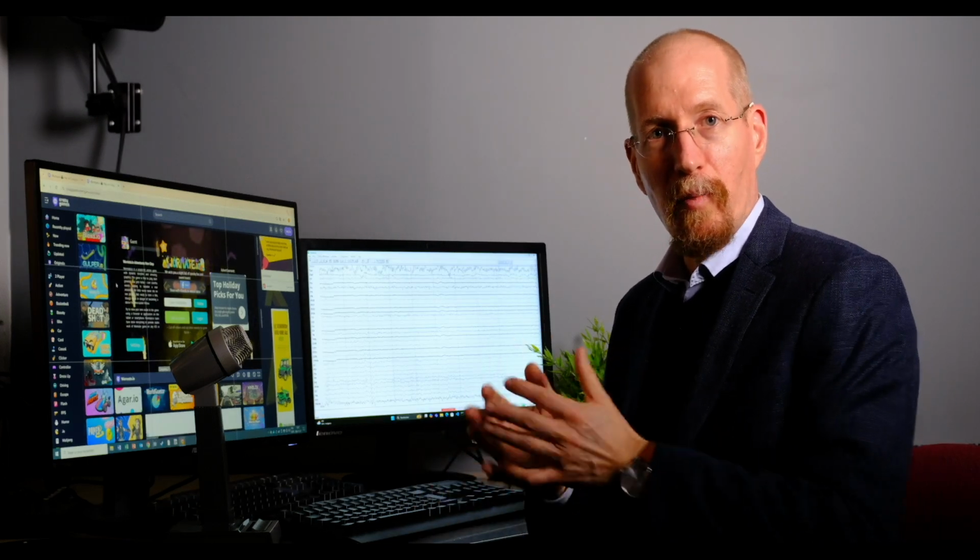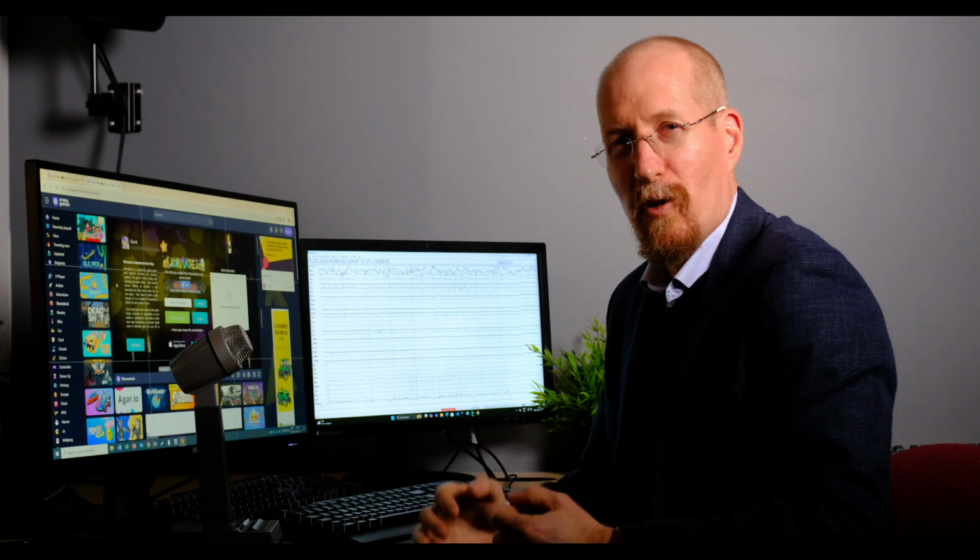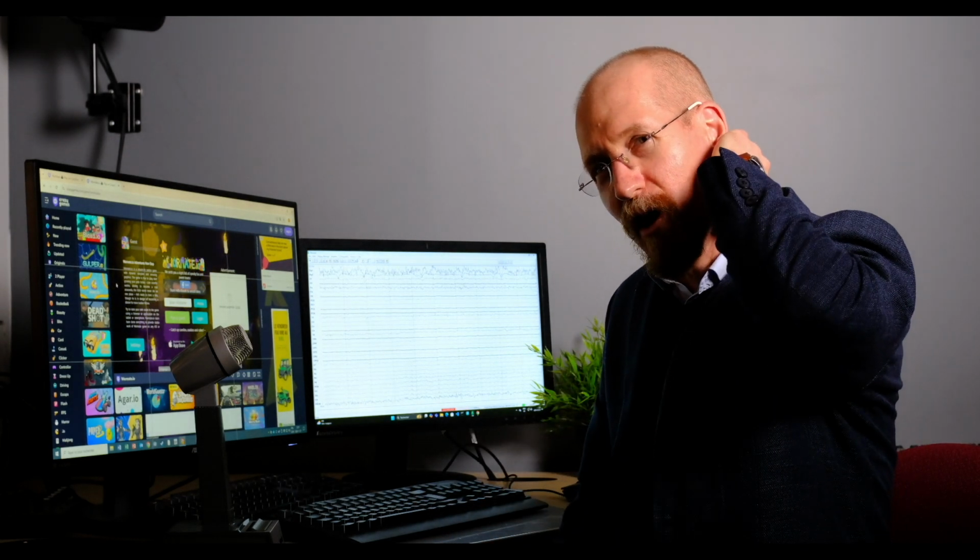You also need to remind the participant to relax or to sit with a certain posture. We want to make sure that we minimize the amount of tension that might be in place in the back, particularly the shoulders. So you want to avoid hunched up positions that could end up causing muscle artifacts, particularly into the occipital electrodes.